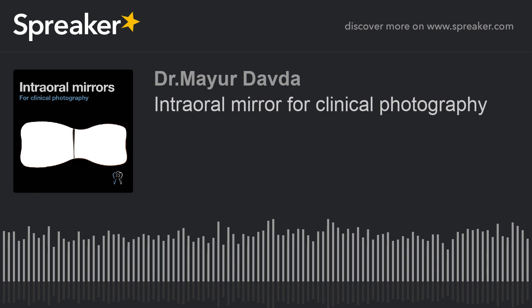I always tell my students, try to use a smaller mirror inside the patient's mouth, as small as possible, but it should be getting your work done. In the sense, it should be narrow enough or small enough, but the mirror edges should not be seen whenever you're documenting your cases. In fact, I hate to see mirror edges, and this is one of the reasons why I do not suggest my course participants or delegates to use mouth mirrors for documenting their cases, which I've seen a lot of endodontists use.